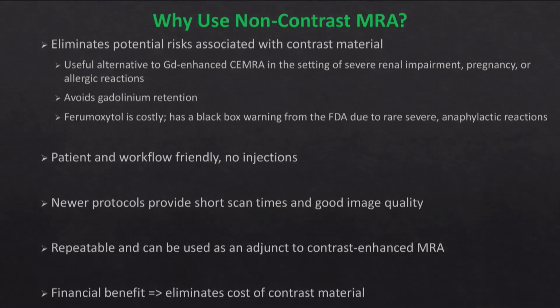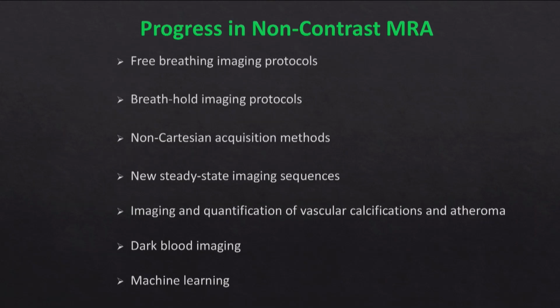All right, so given that, why bother developing non-contrast angiography? And there are a few reasons. One is, gadolinium still, there are concerns about it. Ferumoxytol is rather costly, although I hear there's a generic version that's come out, I was just recently told. It still has a black box warning from the FDA. Our own hospital won't stock this in its formulary, which is a huge problem for us. So that's going to change, but for now, it would be helpful to have something that doesn't require any injections.